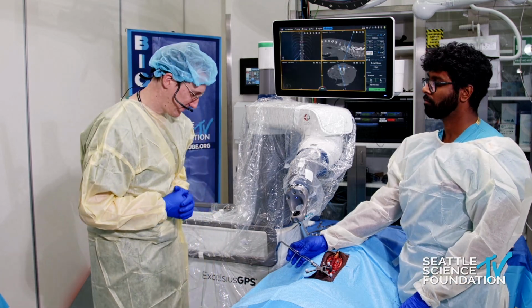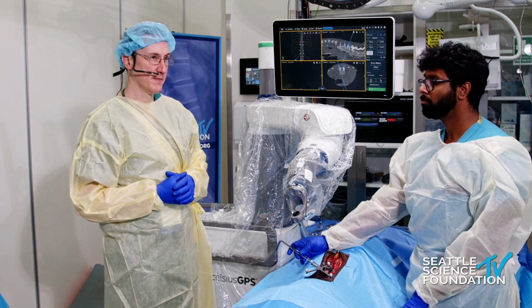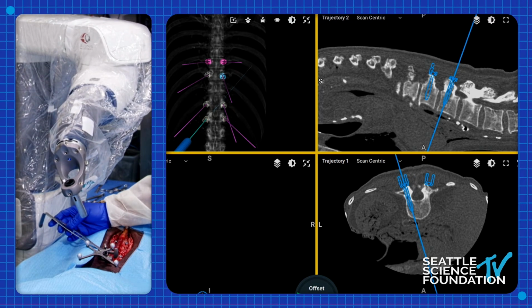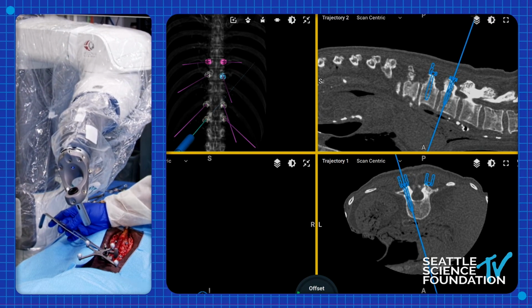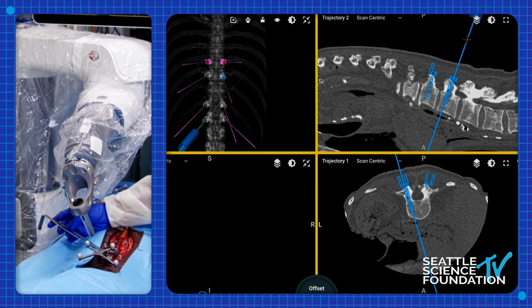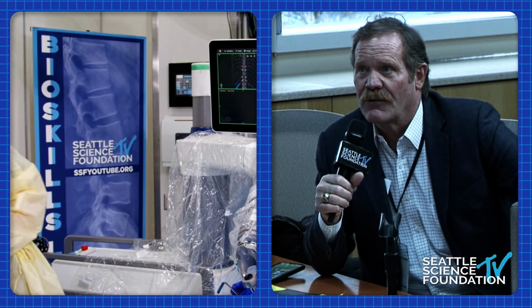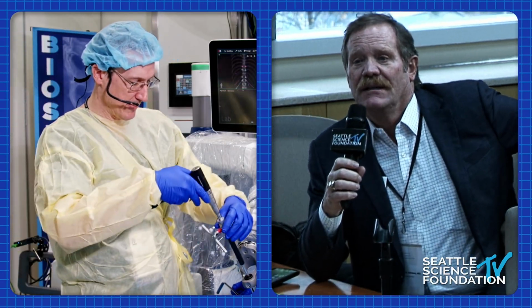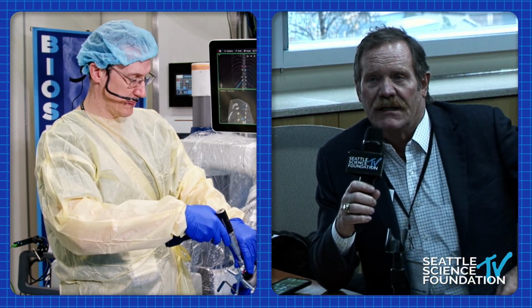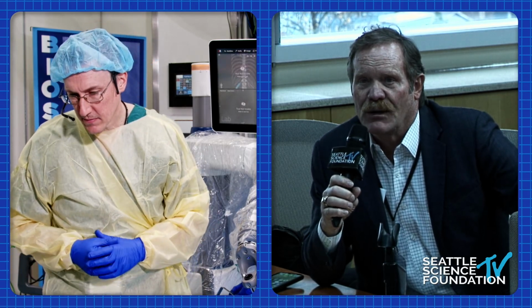Yes, Andrew, Pat Johnson. I love your first premise of this illustrative case was that of a trauma fracture problem. And this is just incredibly good technology. When you have a patient with a chance fracture, you have something that's not really dislocated, problematic, and you just need to fix it in position. And the percutaneous placement of rods.